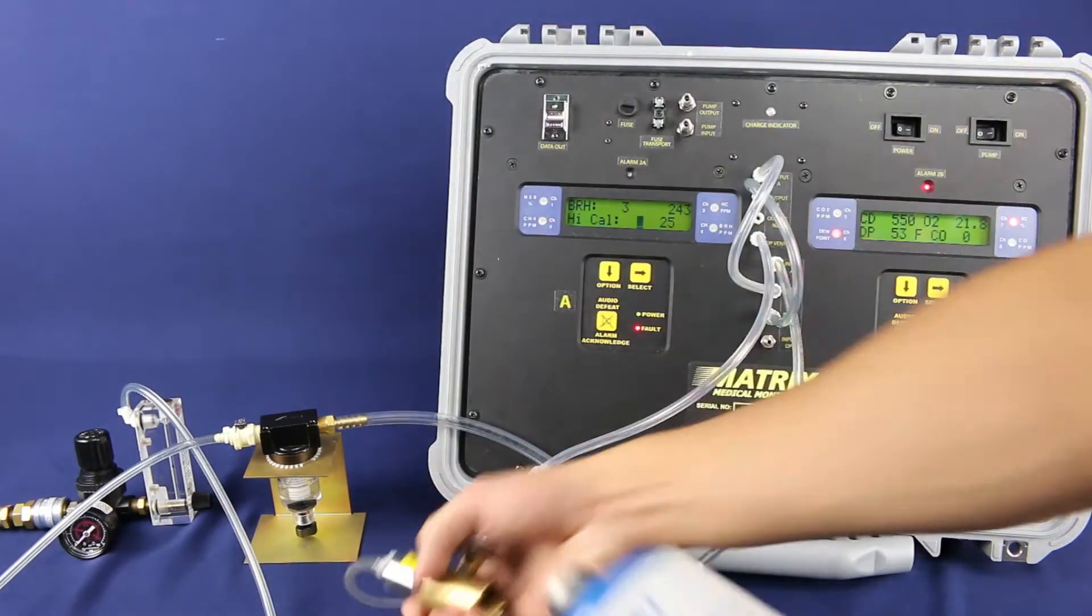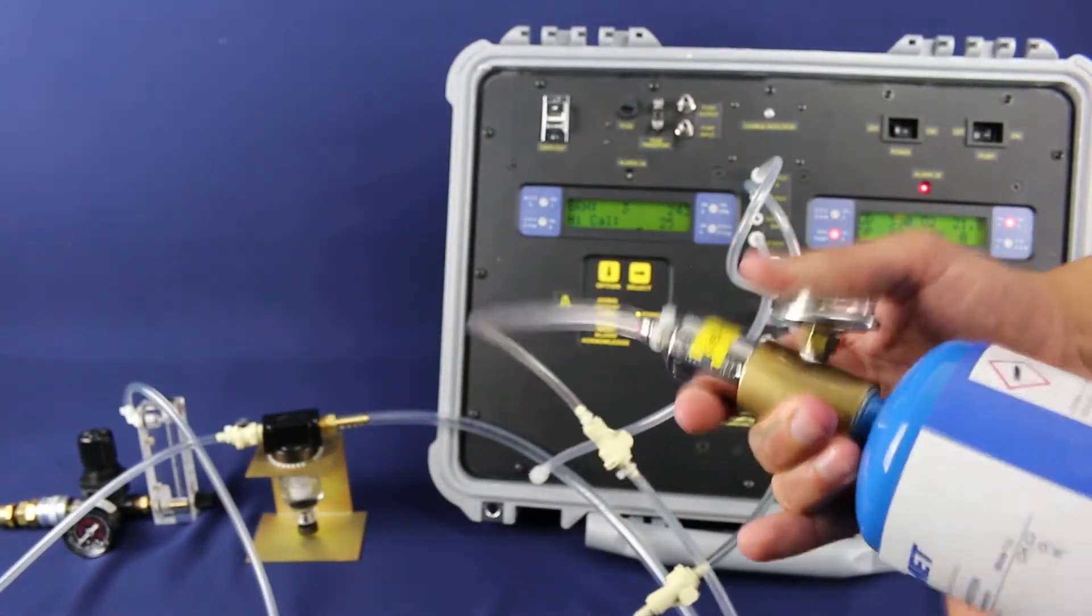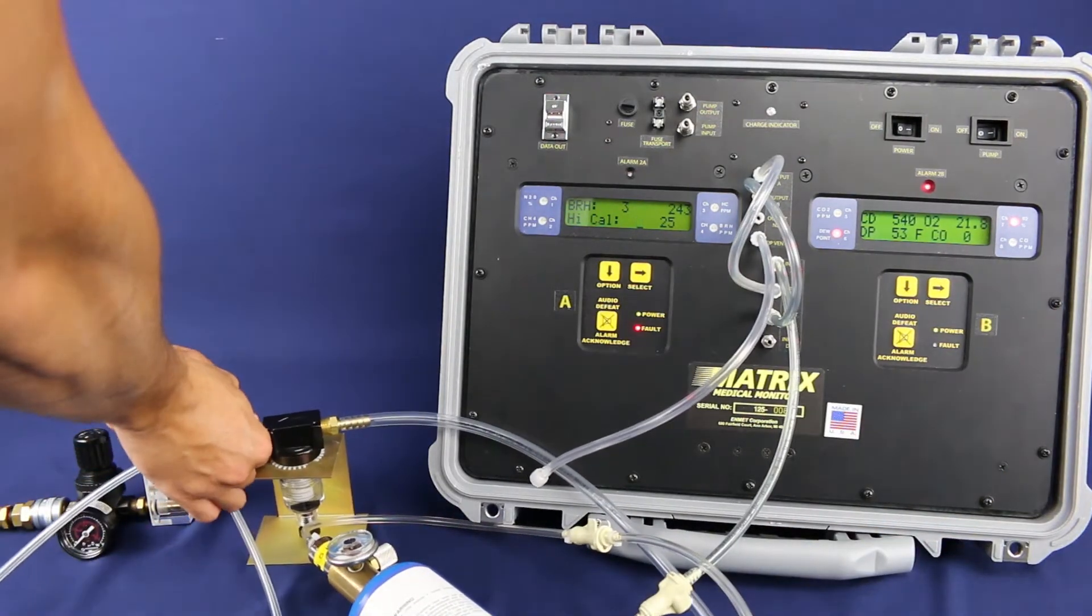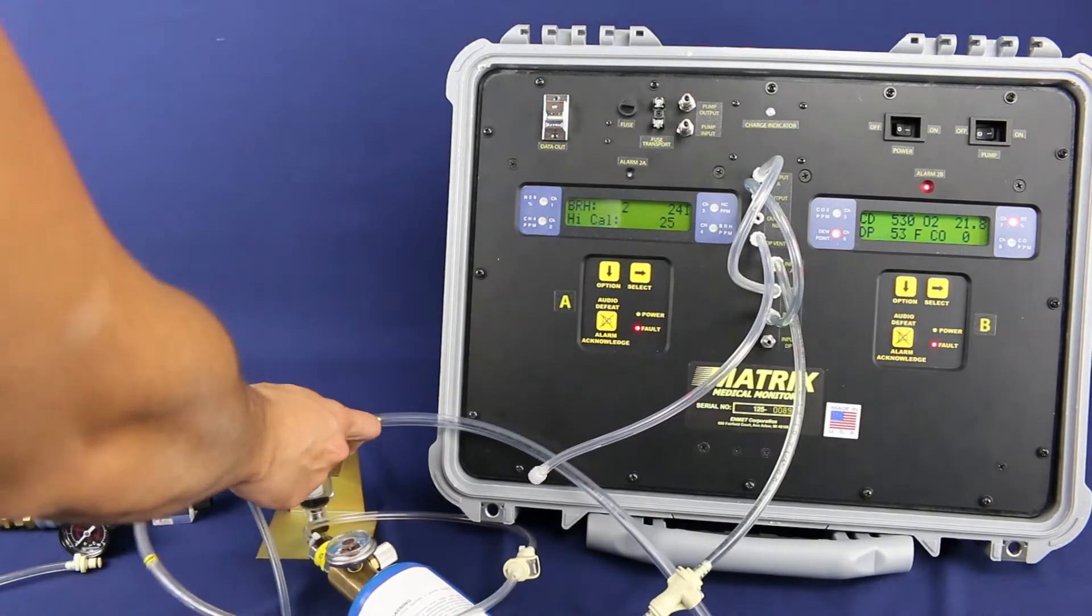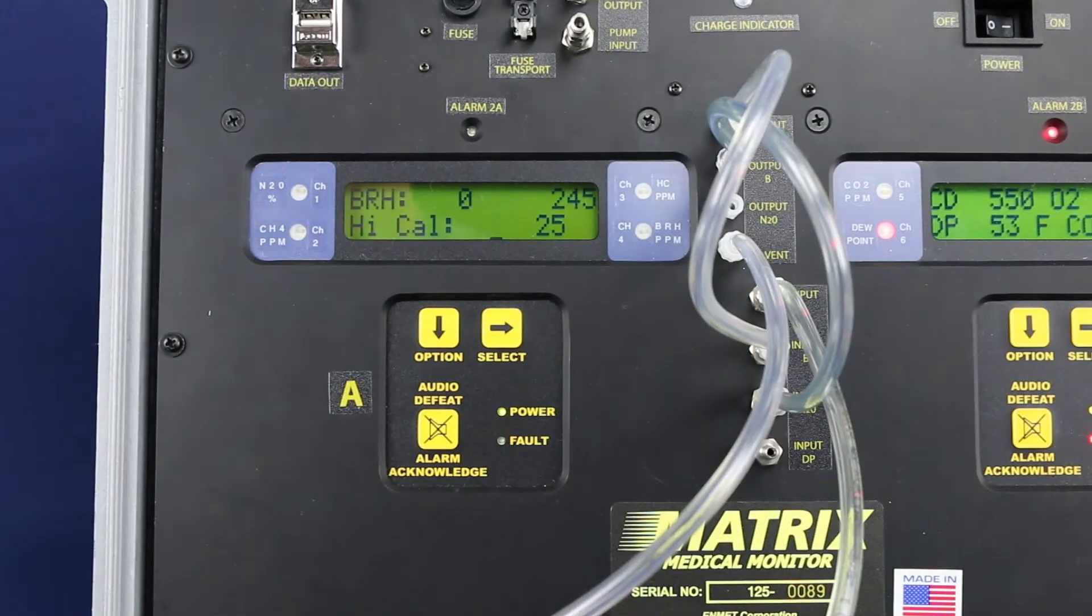Now for the high cal, you will need to attach the 25 ppm methyl chloride cylinder to the regulator, then connect the regulator to the input port of the bubbler assembly and open the regulator valve. You will see the signal on the upper right hand side of the display rise. The present value will be shown on the upper left hand side of the display.